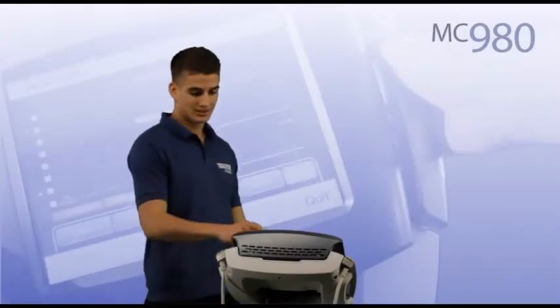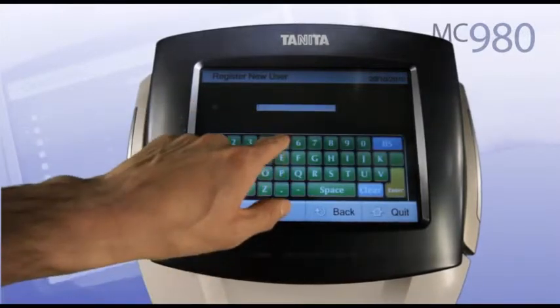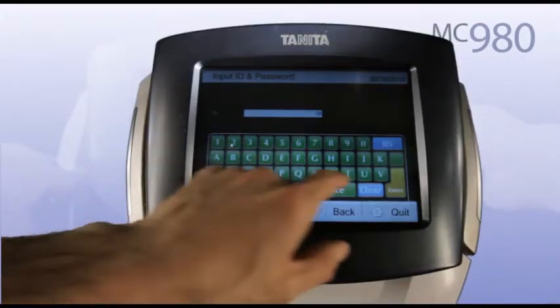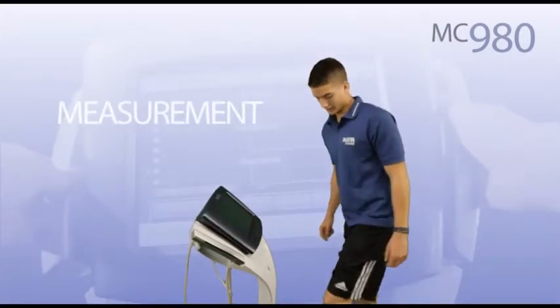After the simple creation of a new user profile, target values can be set as a basis for progress tracking. Comprehensive body composition analysis is performed in 30 seconds. Input the registration number, which will retrieve individual personal data and target settings.